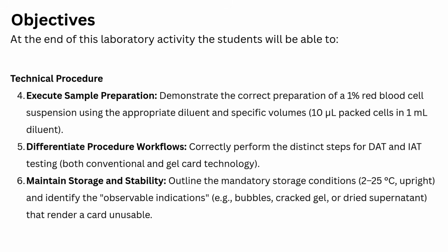Second major objective is for the technical procedure. So specifically, you should be able to execute sample preparation. So by demonstrating the correct preparation of a 1% red blood cell suspension using the appropriate diluent and specific volumes. So it's 10 microliters packed red cells in 1 ml diluent. So that's the DG sol.